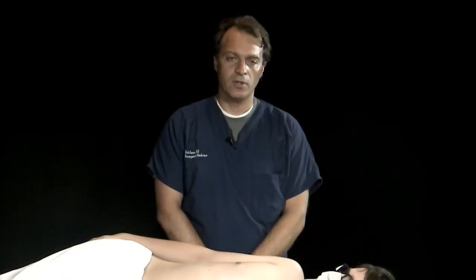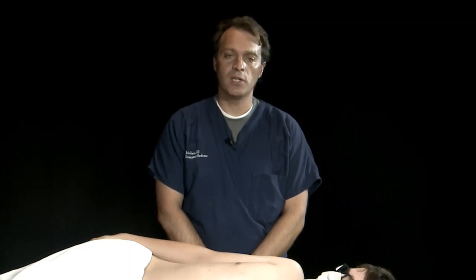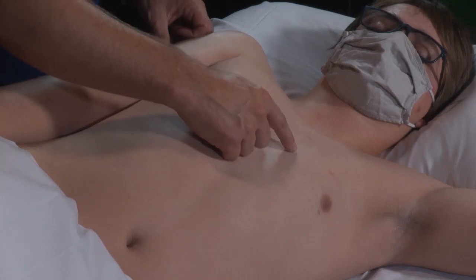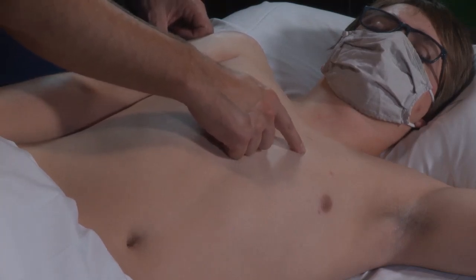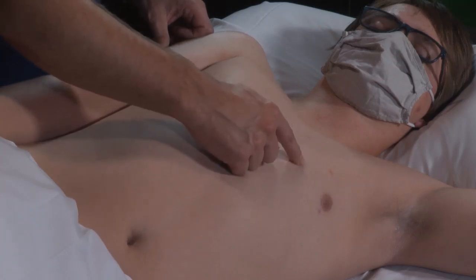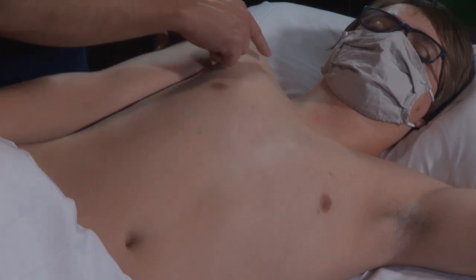For the non-traditional four-view cardiac exam, we're going to start off by imaging in our parasternal windows. Our parasternal windows will be found by placing the probe immediately lateral to the sternum, somewhere between the second and fifth intercostal space. We're going to start off in a parasternal long axis view with the marker dot pointed towards the patient's right shoulder.